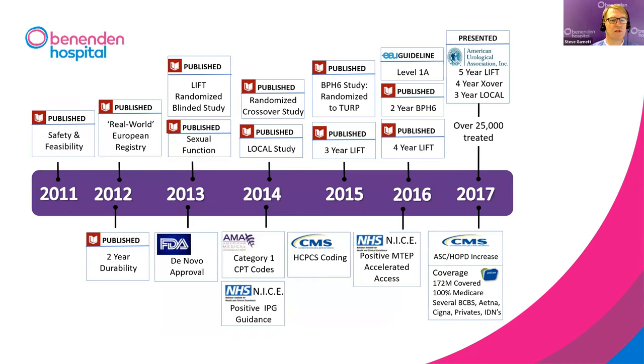Urolift. I'll try and move on. Right. Okay. So hopefully that gives you a better understanding of what is actually being done physically to the prostate and the lobes of the prostate during the Urolift procedure, and shows you very much visually exactly how this treatment opens up the channel out of the bladder, allowing men to pee better once this has been placed.